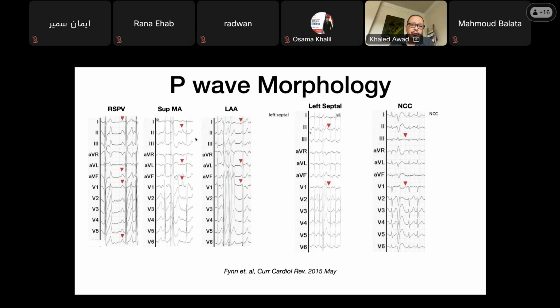The mitral annulus, well, it's high up in the atrium. It's going to be inferiorly directed. We're sort of flat in lead one because we're a lot more lateral, right? And then we're also more anterior compared to where the veins are. So we're going to be positive in V1, but we're going to start seeing a hint of reduction in P wave amplitude as we go through the precordial leads. Counterclockwise mitral flutter kind of looks like that.